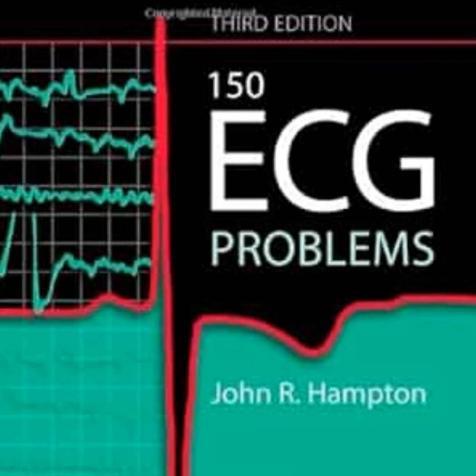They describe the sudden onset of heavy, crushing ischemic chest pain that radiates to their left shoulder and jaw, and it's accompanied by diaphoresis. Classic. The pain started exactly 1 hour ago. You immediately order a resting 12-lead ECG. The tracing prints out, and it is completely normal. No ST elevation, no T-wave inversion, pristine conduction. Based on the principles we've discussed today, do you discharge this patient?